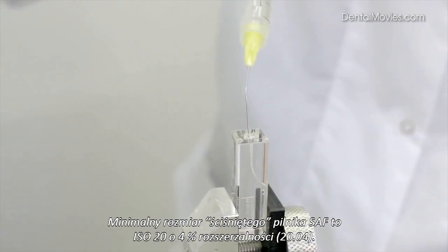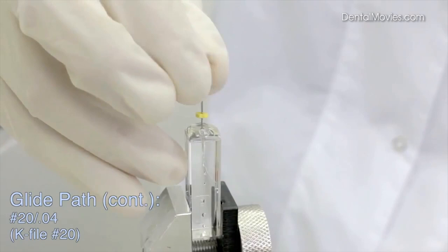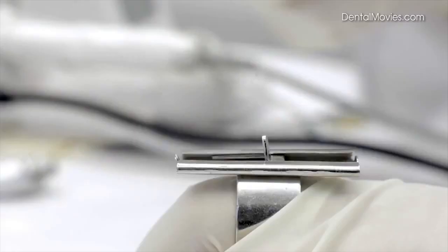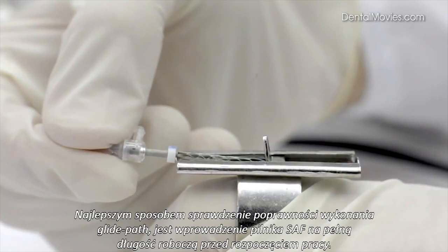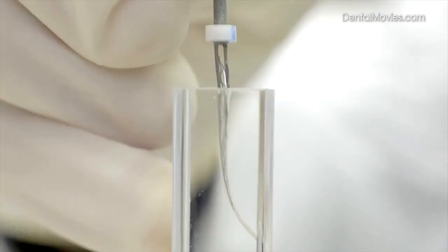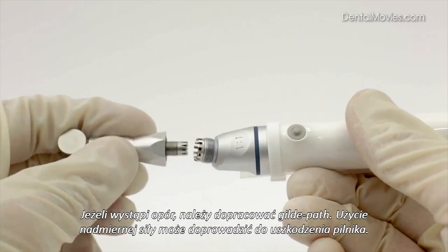The minimal compressed size of the SAF is equivalent to a number 20 file with a 4% taper. A matching glide path can be created using various instruments, from basic hand files and Gates Glidden drills to latest generation NiTi rotary files. More information regarding different options for glide path can be found in the SAF System Clinical Guidelines Manual. The best way to verify the adequacy of the glide path is to try to manipulate the SAF manually to working length before proceeding. Use light pecking motions to insert the SAF to working length. If resistance to insertion is encountered, stop and re-establish the glide path. Excessive apical pressure at this stage may damage the file.